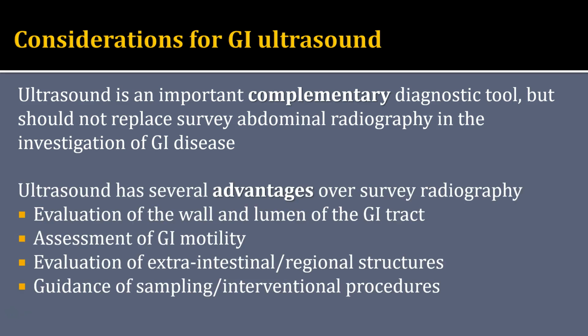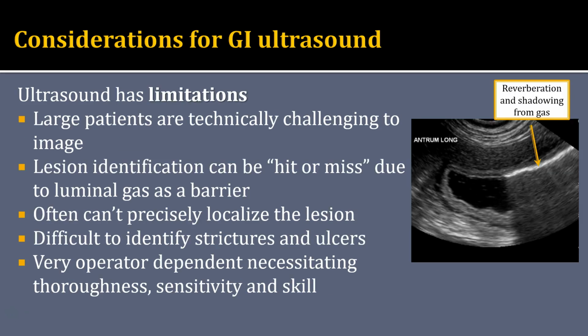Ultrasound has several advantages over survey radiography. It allows us to evaluate the wall and the lumen. It can also let us evaluate motility. In addition, once we identify a disease state, we can evaluate the extraintestinal or regional structures, which may help us with our differentials. And then we can guide sampling and maybe interventional procedures with ultrasound.